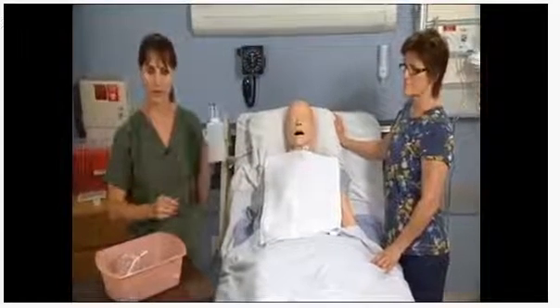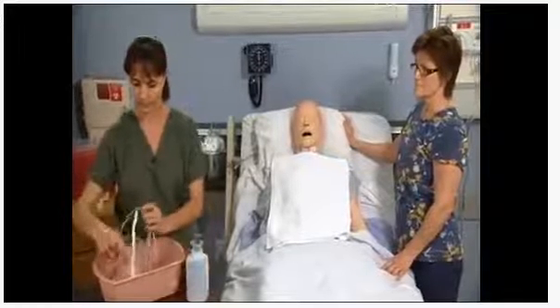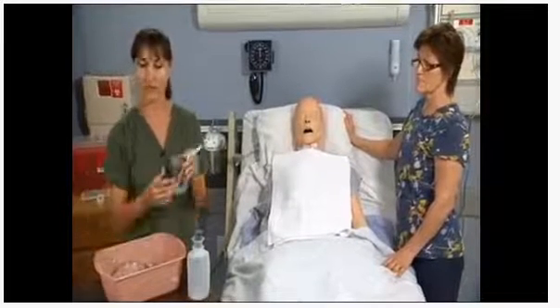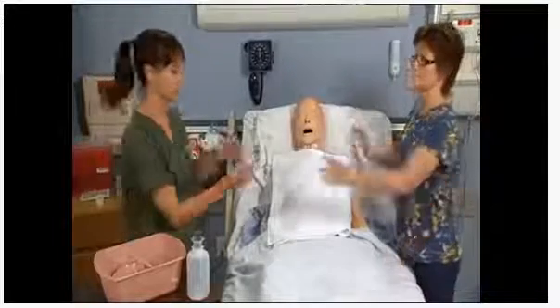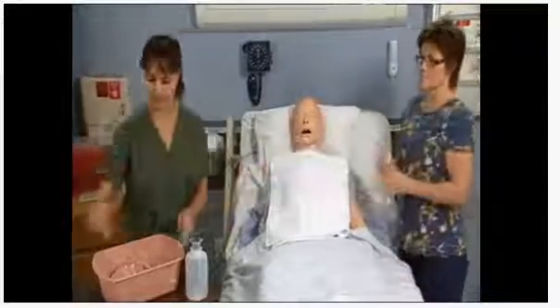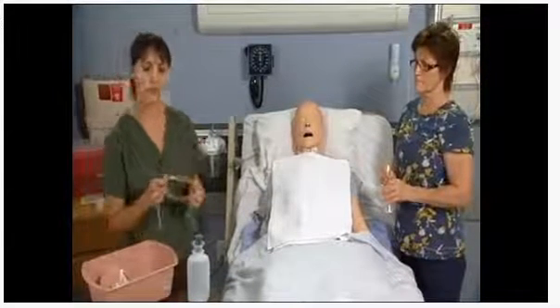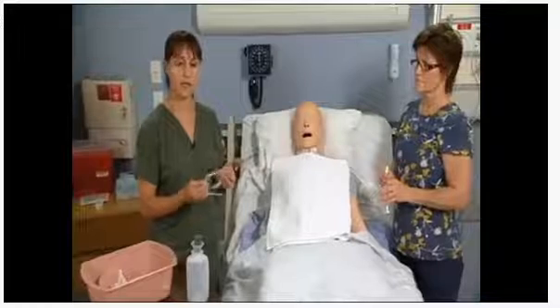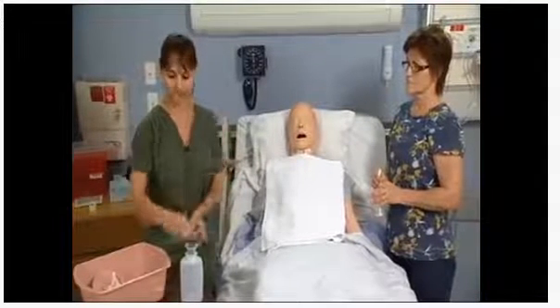I'm going to need an irrigation set. I'm going to need a cup with a little bit of water and some straw, and this is what I'm going to give to my assistant. The doctor's orders say that I need a nasogastric tube for suction, so I'm going to need a Salem sump.